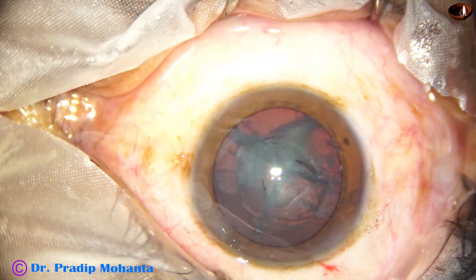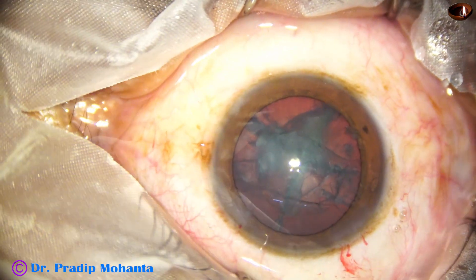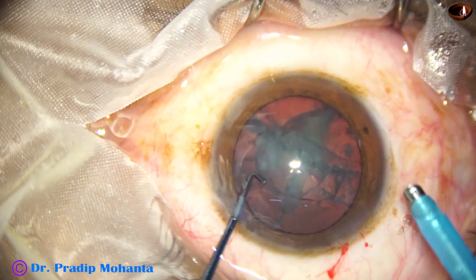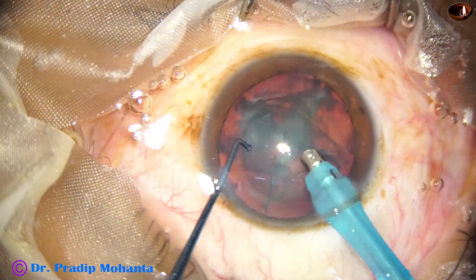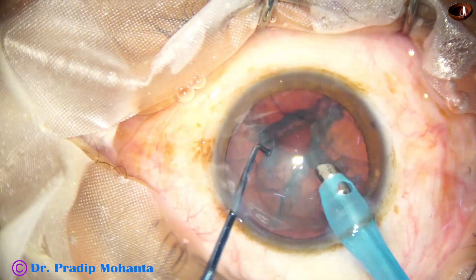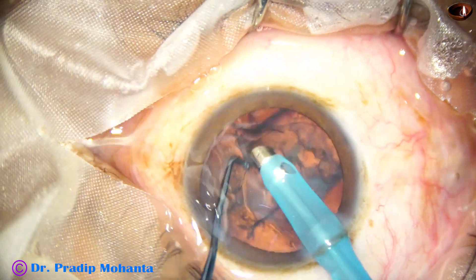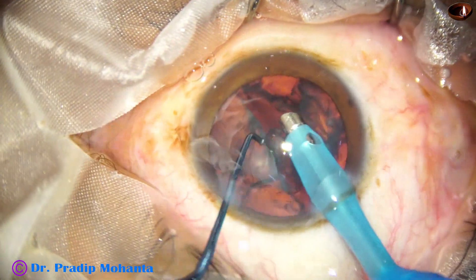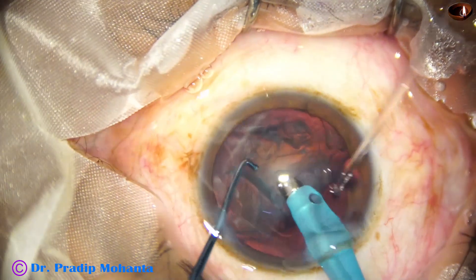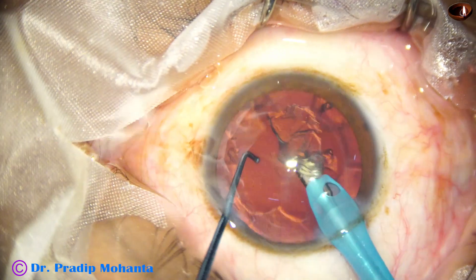Now rotate this visco again and now is the time to use the handpiece to remove the nucleus. The FICO needle goes into the anterior chamber with its bevel down and I try to remove some cortical lens matter — immediately one piece comes out. Then I rotate, place the aspirating port of the FICO needle at the margin of a fragment and it is lifted up and gets emulsified, and then the next one. In no time all the pieces are emulsified.